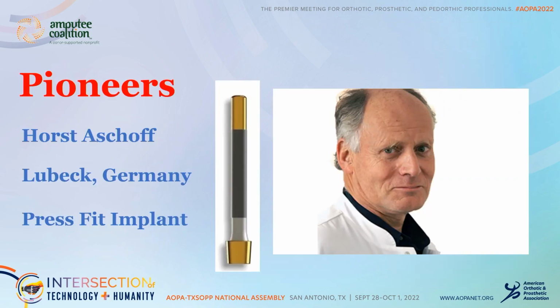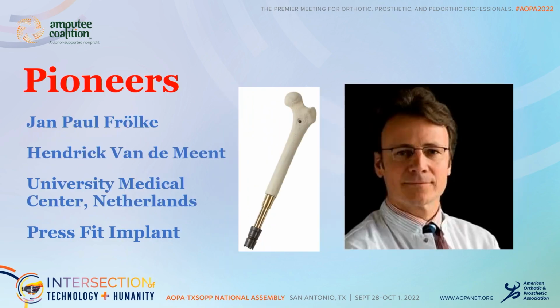The next stage in osseointegration is that there are other kinds of implants that we use in our bodies. Horst Aschoff thought, why not use the same technology that we use to put in an artificial knee or artificial hip, which is a press fit device? It's not screwed in like the OPRA device is. And he invented that and used that in Germany.